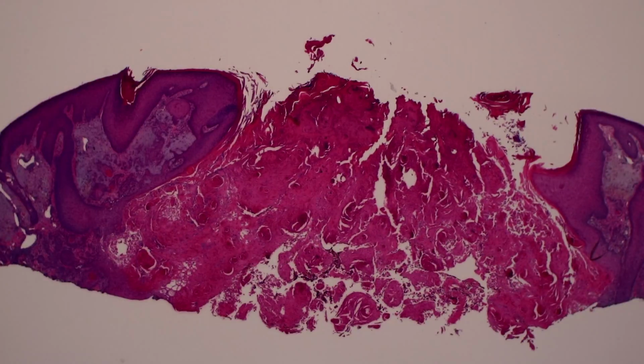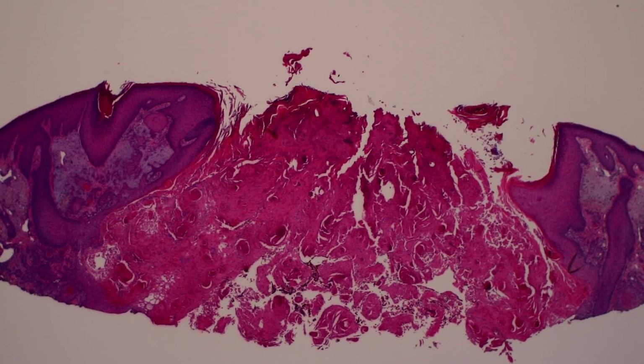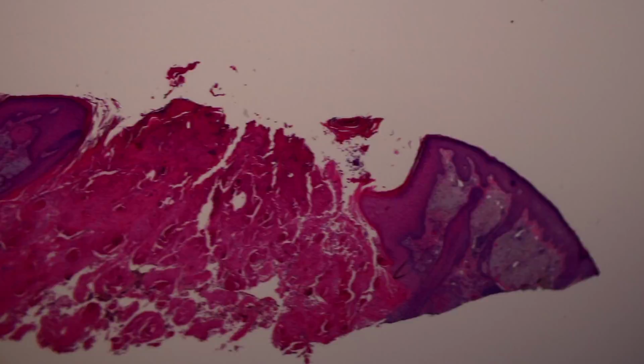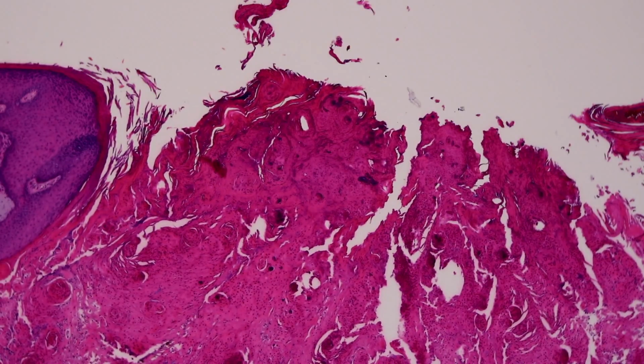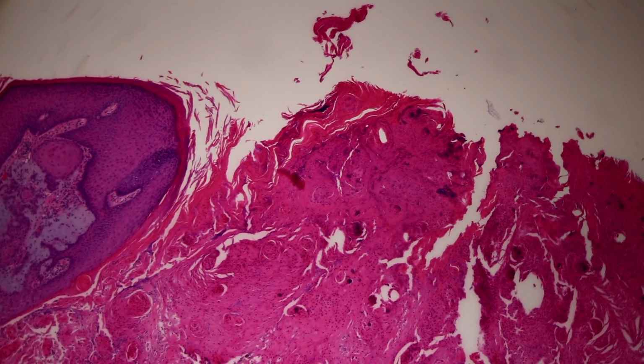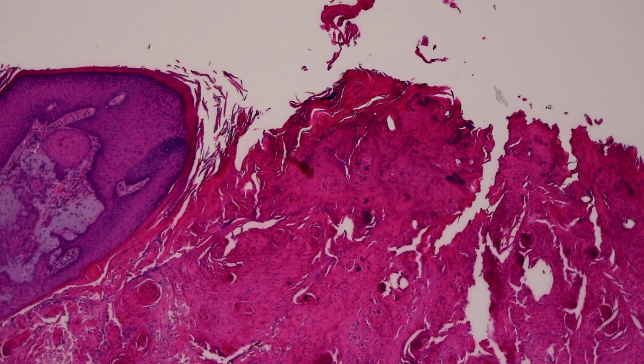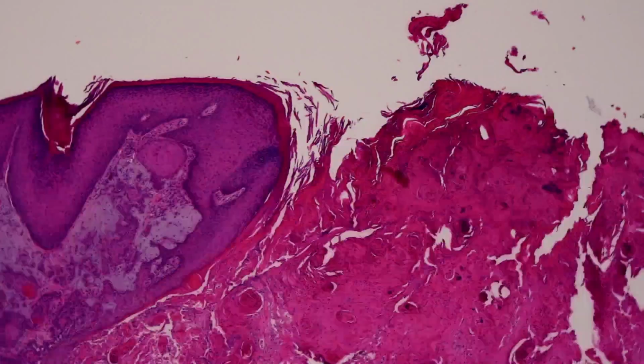Here's another really great example of just how dramatically cystic these lesions can look. A big open kind of crater, and this one's filled with a lot of parakeratosis. And if I see a big cyst with a lot of para, that's usually very worrisome that there's a squame underneath. I'm sorry, I'm having trouble getting the lighting correct here because of all this keratin.